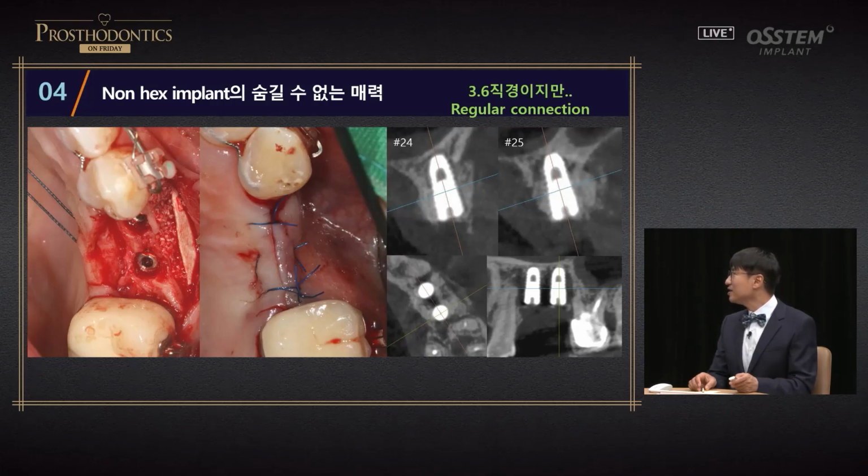If you're excellent in bone graft, this can seem minor, but as a dentist with not so excellent surgical skills, by reducing the diameter, the necessity of bone graft becomes less. So it's really attractive for me.